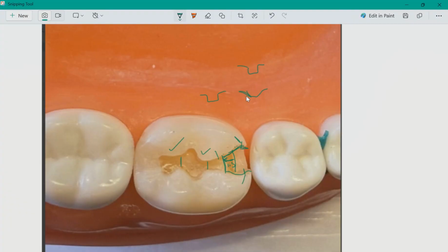Now, for a premolar, it's 1, okay? Molar, 1.5, premolar, 1.0. So pay attention to this distance, measure it, and gently make sure you get there, and then make sure you're following the curvature of the outside of the tooth, so everything is symmetrical with each other.